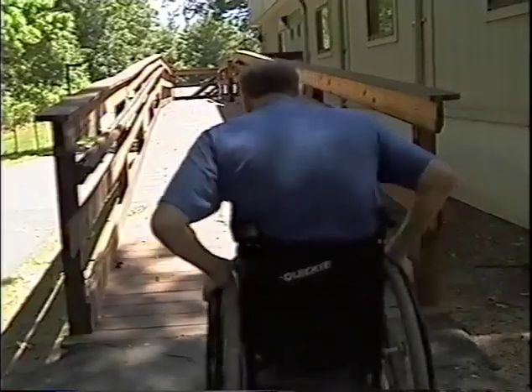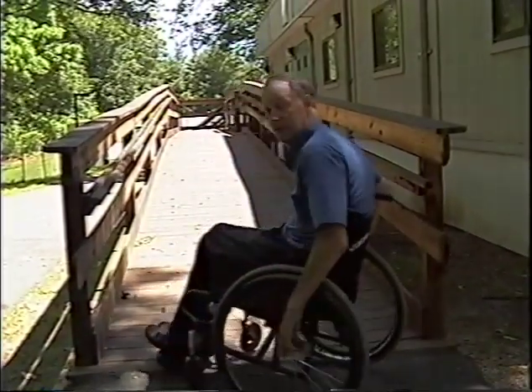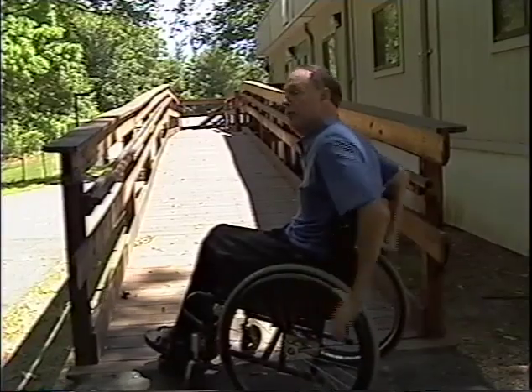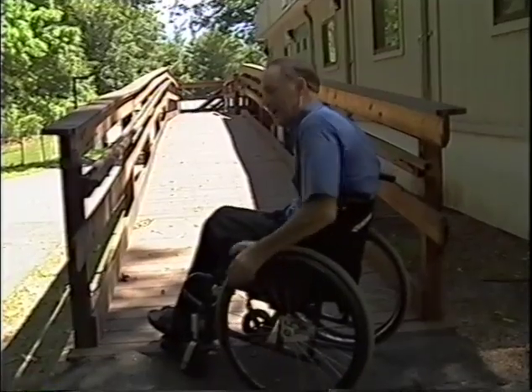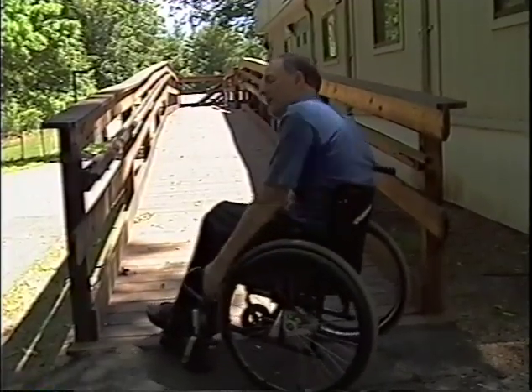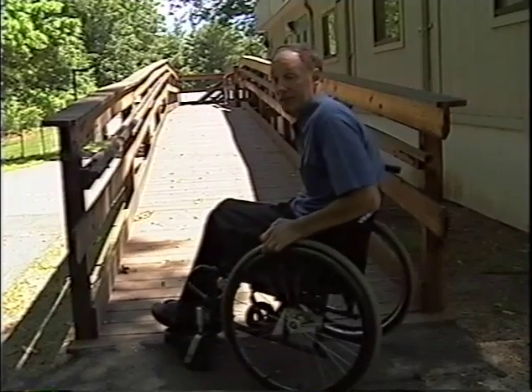Going up ramps is basically a matter of keeping your weight in front of the axle. You shouldn't be coming back here because you'll be pulling the front end up. Keep your weight in front of the axle, cut your stroke in half, and do that little half stroke that most people naturally gravitate to.